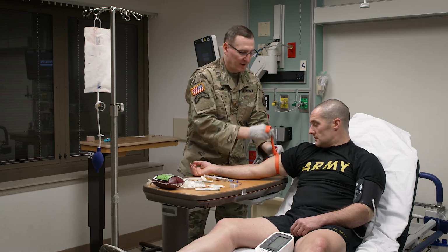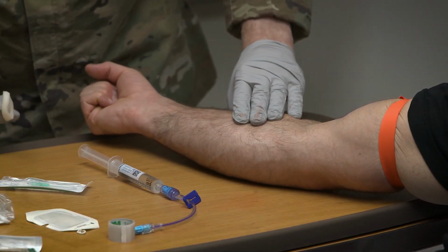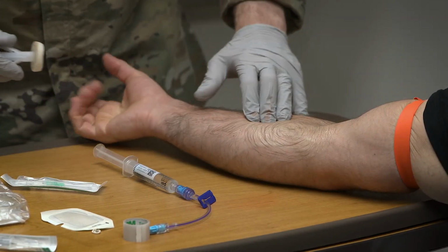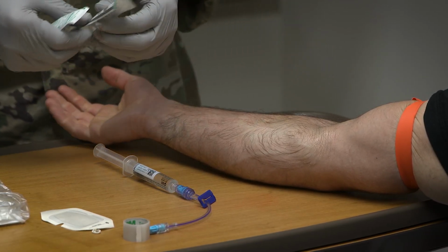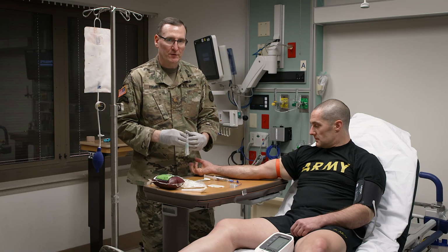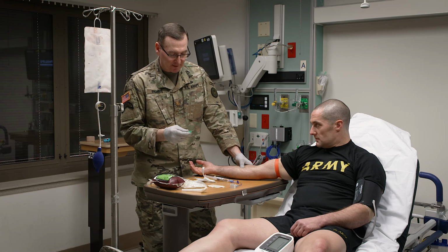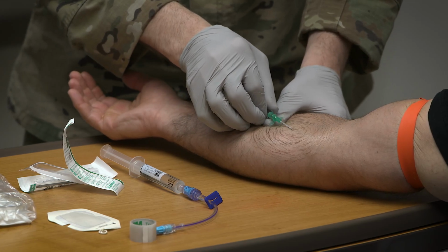Go ahead and put the constricting band high up on the arm. If your casualty can participate, have them squeeze their fist back and forth like that. All right, once you identify a nice vein, go ahead and prep the area. Again, using something like chlorhexidine is preferred over using an alcohol prep. You can use anywhere from an 18 gauge, 16 gauge, even a larger 14 gauge if you feel comfortable doing that. Just make sure that whatever size gauge you want to use, you have an acceptable vein that will accept the angiocath. Okay, big stick, 1, 2, 3.